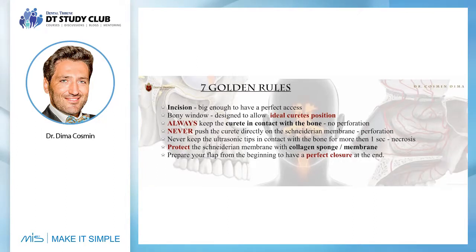Never keep the ultrasonic tips in contact with the bone for more than 1 second. And I'm talking now about the intralift system, which is a system used for internal sinus lifting using the piezosurgery. And I will show you one case with this technique. It's very important not to stay with the tips too much in contact with the bone, because if the contact is too strong with the bone, the saline solution could not enter between the bone and the tip, so we can provoke necrosis. Protect the Schneiderian membrane with collagen sponge or collagen membrane.